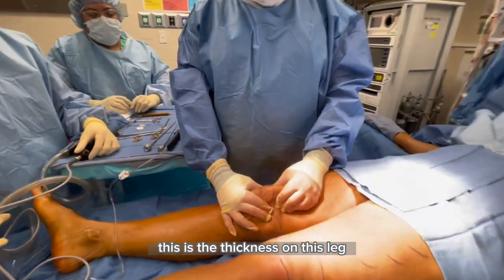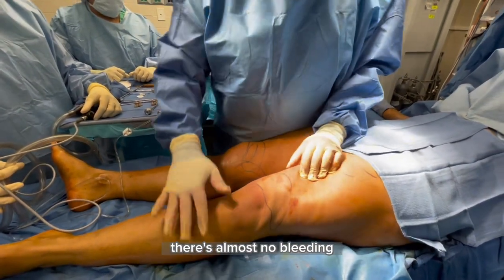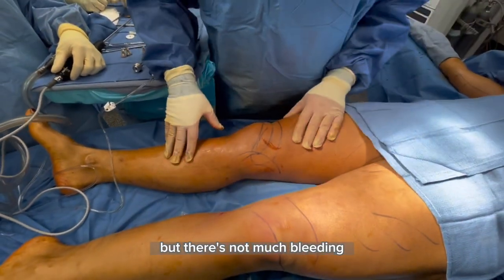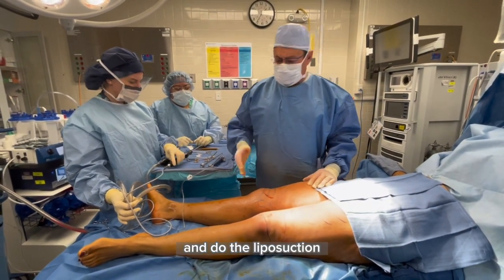This is the thickness on this leg, and this is the thickness of the skin on the knee. It's significantly better, and you see there's almost no bleeding — just a little fluid oozing out of these small openings. So now we're going to do the other leg the same way: infiltrate it, do the VASER, and do the liposuction.